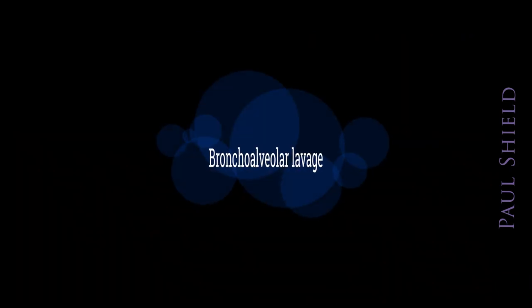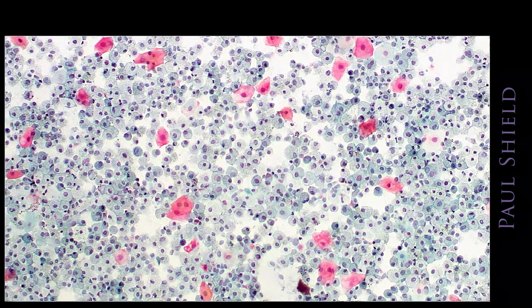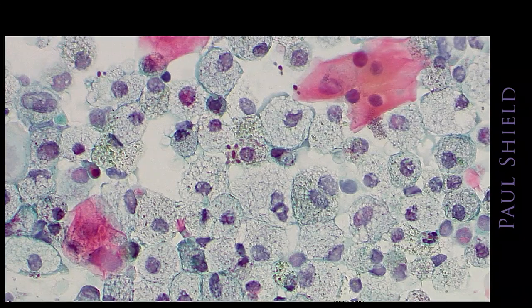So in bronchoalveolar lavage, or BAL, what we're doing is sampling the alveolar spaces. So you should have predominance of alveolar macrophages, which is what we've got here. Often there's a bit of contaminant, so you can see squamous cells around here, and you'll sometimes have bronchial epithelial cells scattered in amongst those macrophages as well. But it should be pretty much a deep sample of the lung airways.